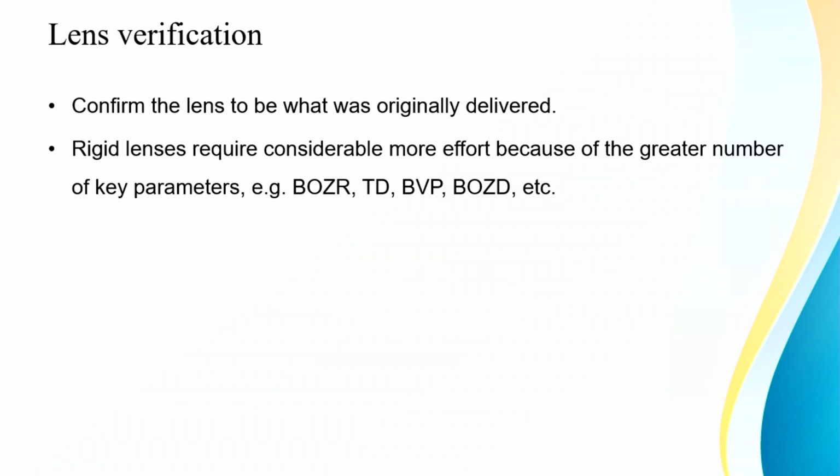So we also do the lens verification. Practically it's not possible in soft contact lenses to check the power, but we can do it in soft also. RGP lenses, we can very well check the diameter, base curve, and power of the lenses. This helps us tell whether the patient has mismatched lenses if the patient is having blurry vision. And the second thing, many patients, RGP specifically, will be using old lenses which they got a year or 2 years back, which can have lens flexure, the lens shape can change, the lens fit can change, ending up in discomfort and improper lens fitting also.